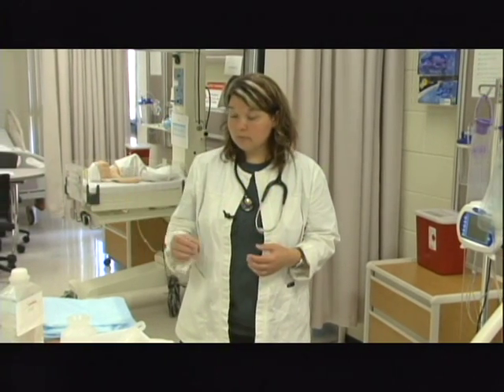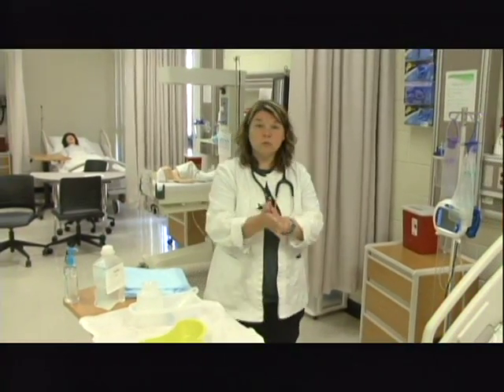So we've been outside the room, we verified the order, we would need to gather any equipment that we needed, and then before we enter the room, make sure that we're mindful of the procedure. So I'm going to enter the room, I'm going to knock, I'm going to provide for privacy, I'm going to go ahead and foam in.